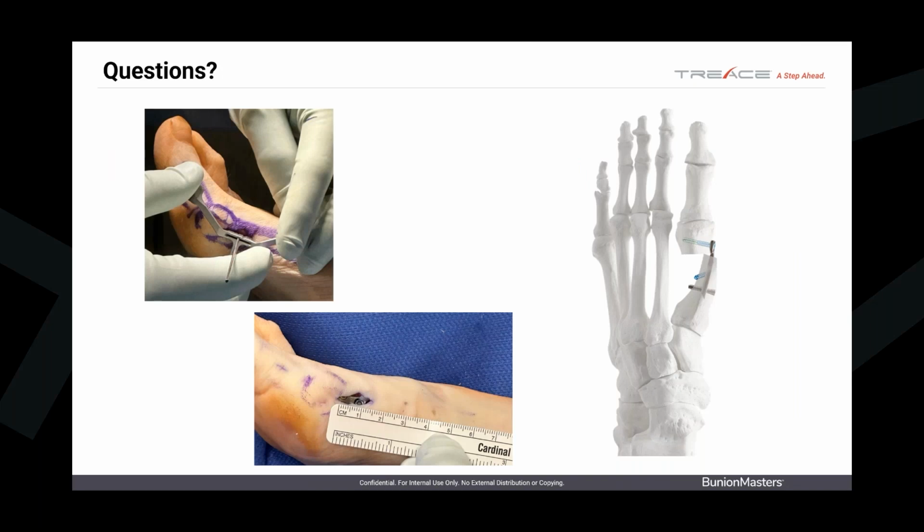We had another question come in asking for any tips on plate position during insertion in the metatarsal shaft, specifically on the AP from a medial lateral standpoint. Yeah, the best correction you'll get is if you guide your plate as lateral as possible. So if you want to insert your Freer, you come at an angle to course along the lateral wall of the metatarsal, and then your plate will actually just guide into that position, into where you kind of created a line for it.